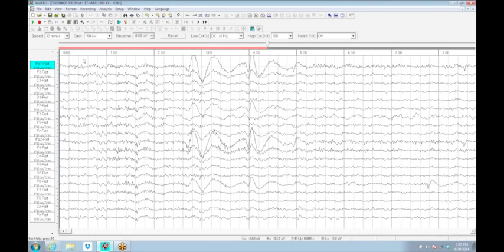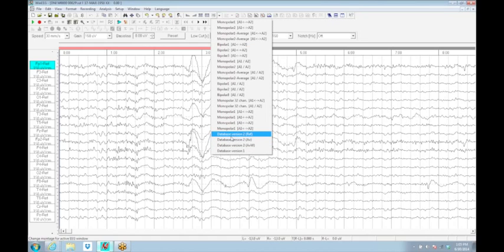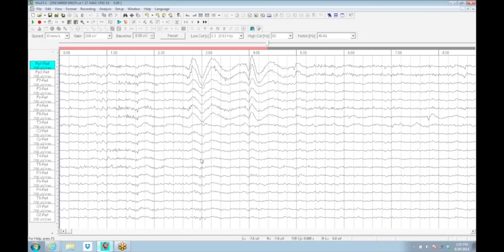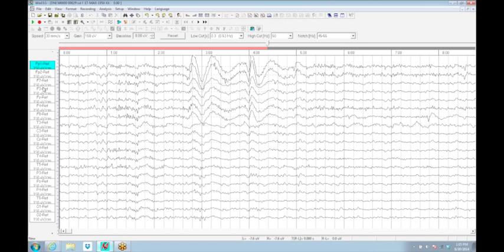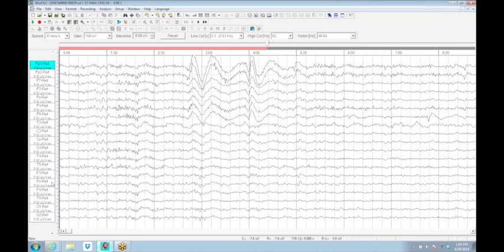I rescale it, turning down the sensitivity slightly, and we see eye movements out of the frontal areas. I'm going to switch the montage to one of the reference database montages, which is left-right: left-to-right frontal, left-to-right temporal, left-to-right posterior temporal parietal, and left-to-right occipital. Left-to-right is an American convention.